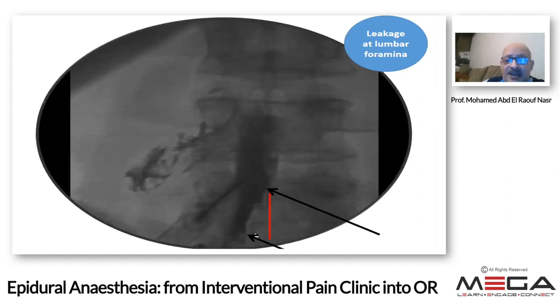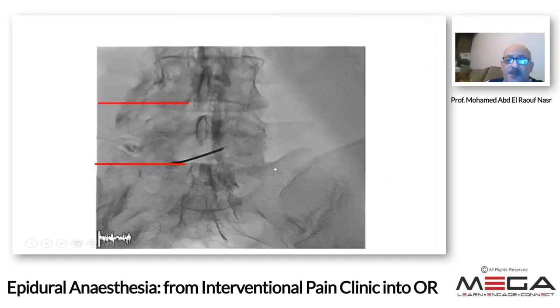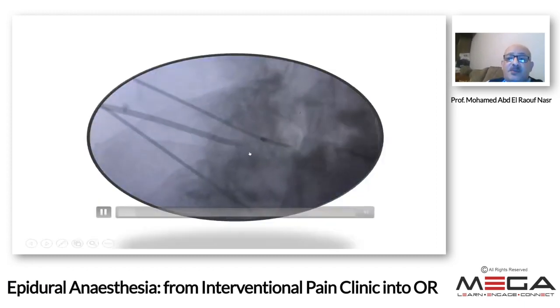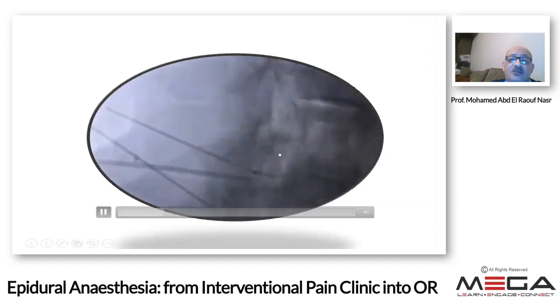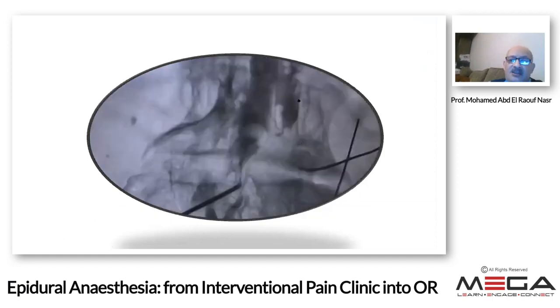Here we find an area that does not receive dye. If you look at this video, the AP presentation of such a patient, there is a missing area, no dye present here, and this can easily lead to patchy distribution. In this particular patient, we go with the epidural needle and inject our dye, and you see not all the anterior spread in the anterior space.